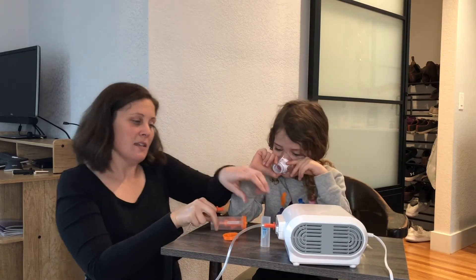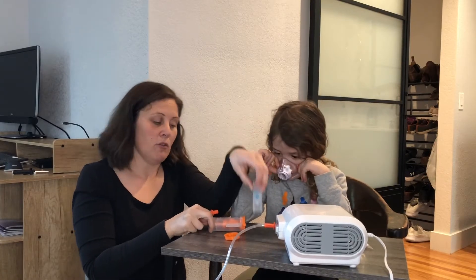We just got this new nebulizer for Leo and we are going to show you how to use it. This is a compressor nebulizer, so it's a little bit bigger than some of them and a little bit stronger. It comes with everything that you need — we have the compressor, a couple different size masks, and we also have a mouthpiece.